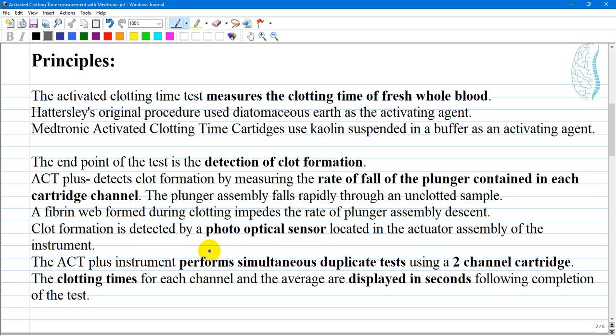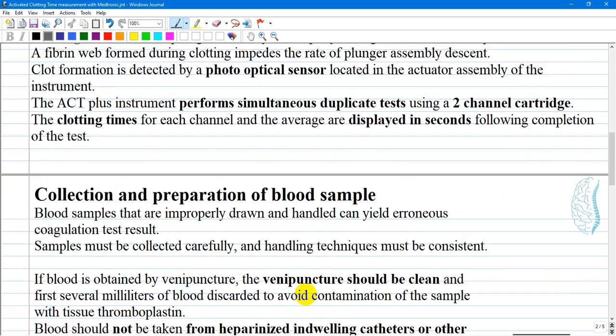Clot formation is detected by a photo-optical sensor located in the actuator assembly of the instrument. The ACT+ performs simultaneous duplicate tests using a two-channel cartridge. The clotting time for each channel and the average are displayed in seconds following completion of the test.